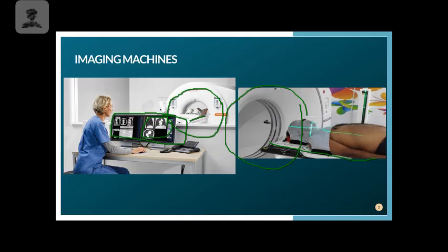Within all of our imaging rooms, for CT or MRI, we have to have some type of laser accuracy. So we have a laser off to the right-hand side, one off on the other side of the patient, and one that shines on top of the patient. We can find our crosshairs where those lasers overlap. We can find those little components to help us identify where we need to line up the next time.